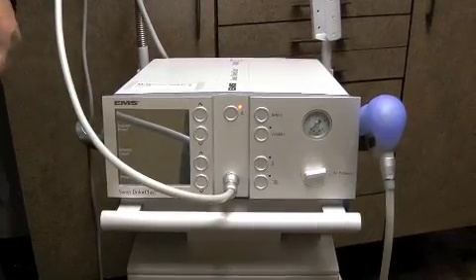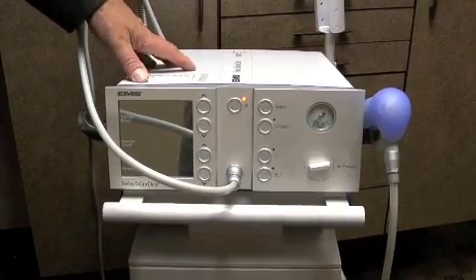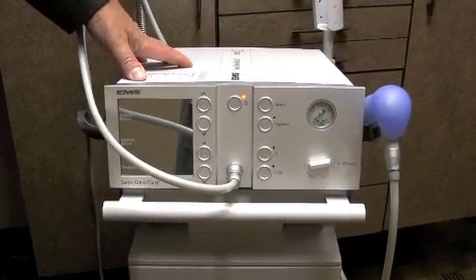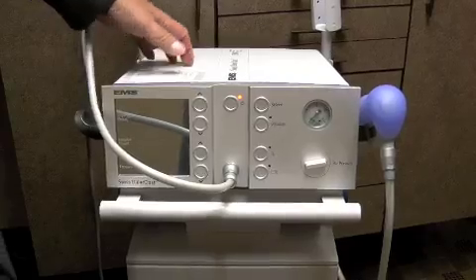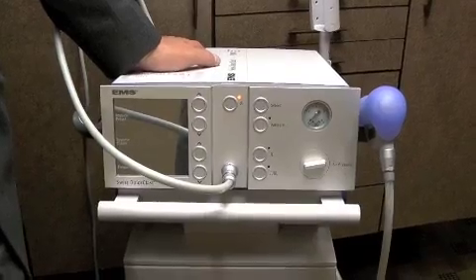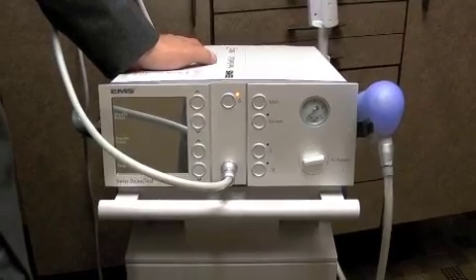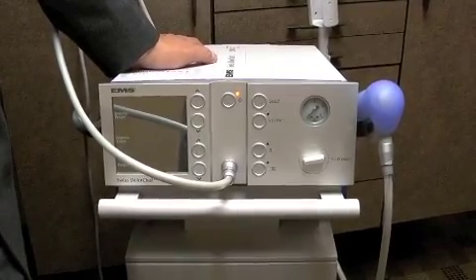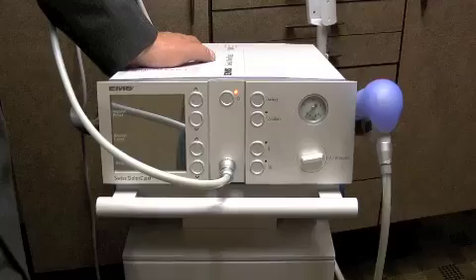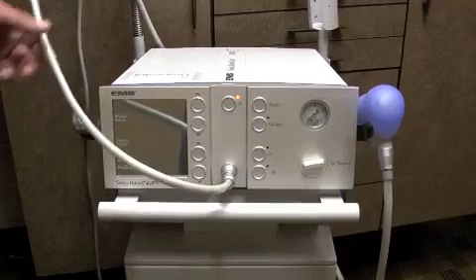Okay, this is the EMS Dolorclast machine. This is considered a non-focused extracorporeal shockwave machine. The purpose of this machine is to create extremely strong sound waves that will go in and pulverize, to some extent, the soft tissues in a medical way so as not to injure them, but to create a type of trauma to the area that will stimulate new vascularization to the tissues and create increased healing.